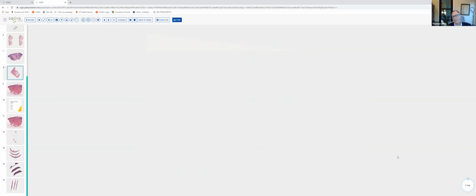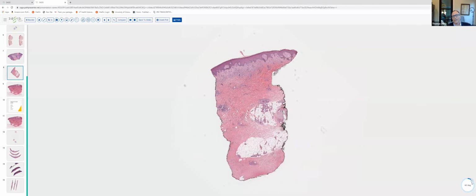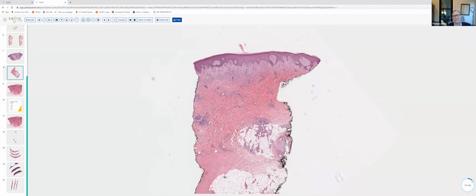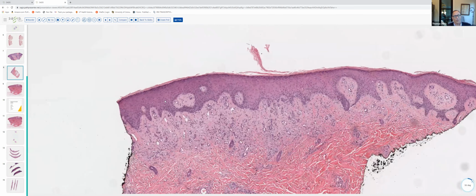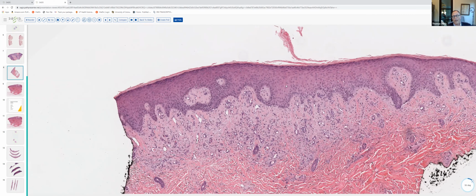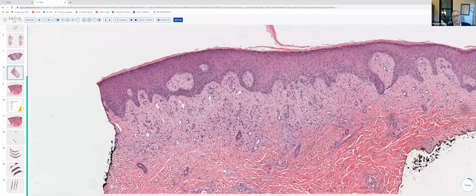Another example of a spongiotic dermatitis, which has a few more defining features, is a stasis dermatitis. And this is kind of a chronic lesion. There's actually not much in the way of spongiosis here. There is a little bit of irregular epidermal hyperplasia, a little bit of spongiosis, a little parakeratosis within the stratum corneum. But what we can see is pronounced nodular angioplasia within the papillary dermis.